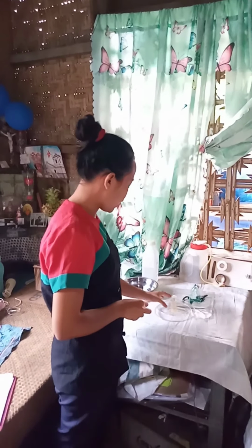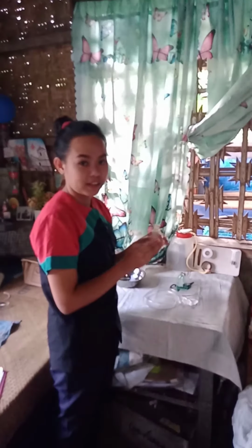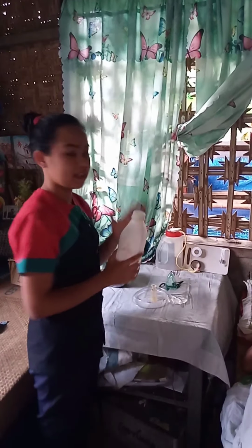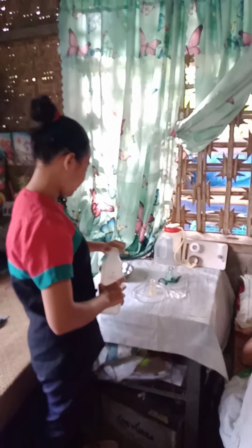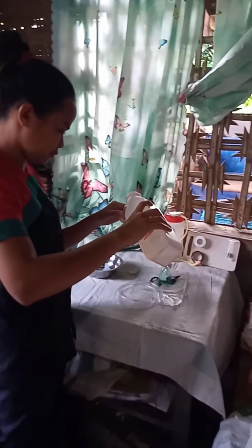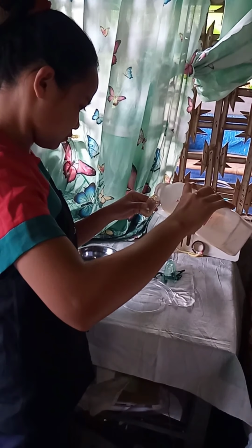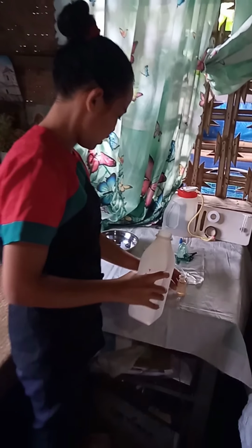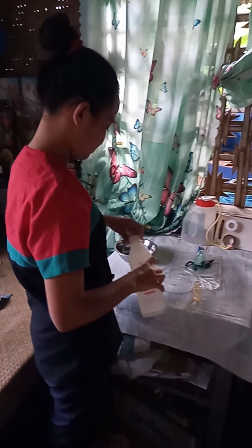After that, we really need to check the oxygen source setup. Then we have here the humidifier line. Then we need to fill it with this distilled water. Then close it.